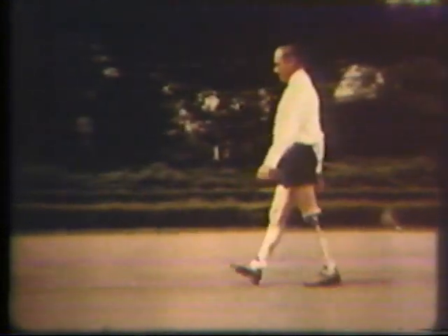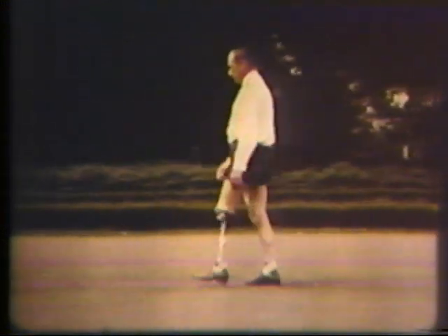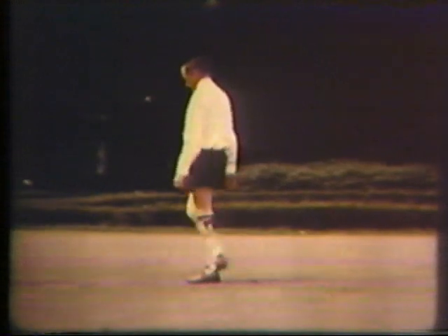The feet remain about equal distance apart in both the swing and stance phases of gait. The knee presents no excessive movement, the pelvis is level, the trunk has no undesirable side-to-side or forward and backward movement, and the arms swing equally and easily.